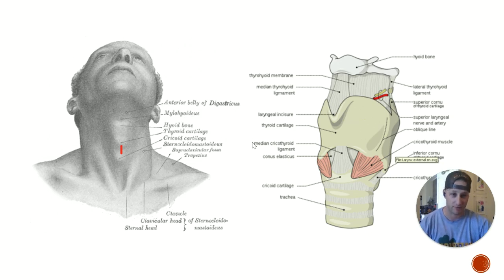That's fine. That's normal. Don't get too lateral, okay? Stay midline. There are important arteries like we discussed earlier in that other picture, so don't go too crazy. You'll cut into the thyroid gland and you don't want to mess with that, okay? That's how I do a cric.